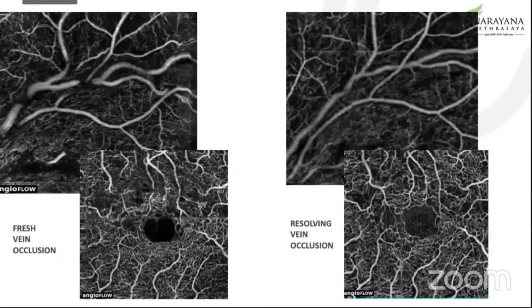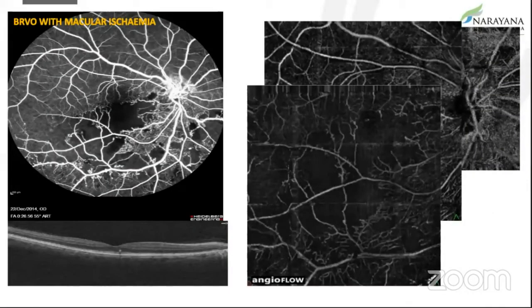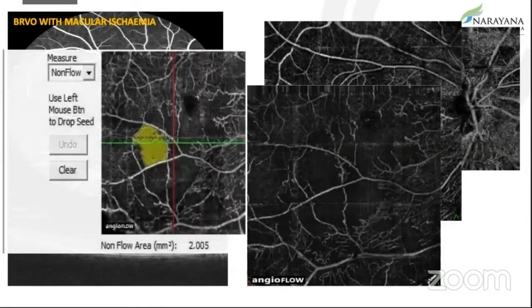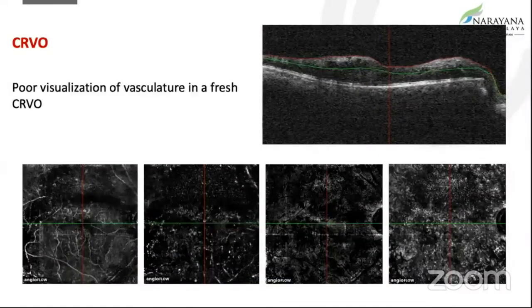This is a patient with fresh vein occlusion, as against resolving vein occlusion — you can see the tortuosity and dilatation of the vessels very well, and also resolution of the edema with treatment and time. Patients with BRVO and macular ischemia are so well delineated on OCTA and very comparable with dye-based angiography, and you can map out the area of non-perfusion. But because of edema in fresh CRVO, sometimes the vasculature may not be visualized. So we do get a lot of artifacts and poor fixation because the vision is so low.